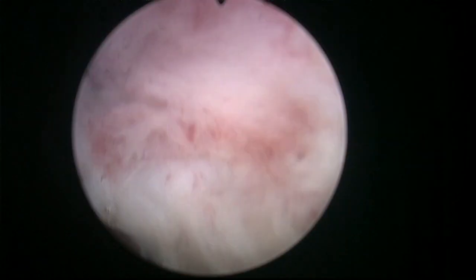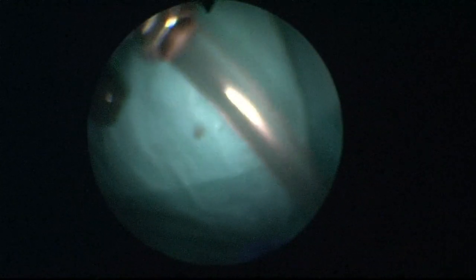Let's see if we can do a fast change of instruments without decompressing the bladder too much. Thanks. Change the bag for me, because I think it's almost full. Okay. Now the urine coming out is quite clear, it's not very bloody, so I think we can progress to morcellation.